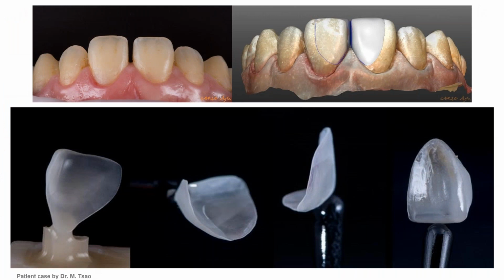So here's a good example of a case in which you've got micro-layering. You're looking at, well, I want to fill in the gap. My patient is complaining about the spacing. They want to look, in their eyes, normal, no space. You do minimal prep because the teeth are vital. They're in good shape. There's really nothing wrong with them. All they're trying to do is cosmetic.